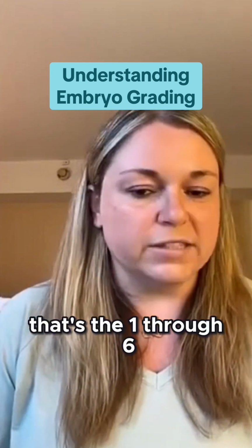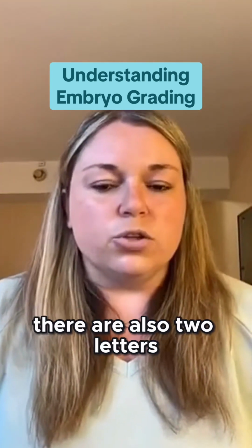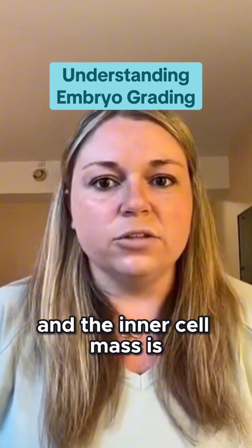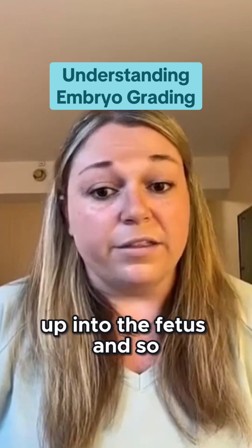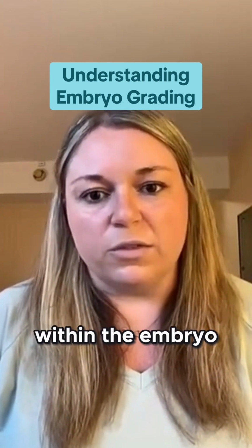So that's the 1 through 6, and the number, it's again the level of expansion or stage of development. And then there are also 2 letters that usually accompany that. So the first letter refers to the appearance of the inner cell mass. And the inner cell mass is the part of the embryo that will develop into the fetus. And so it normally appears as sort of a round or semi-round grouping of cells within the embryo.